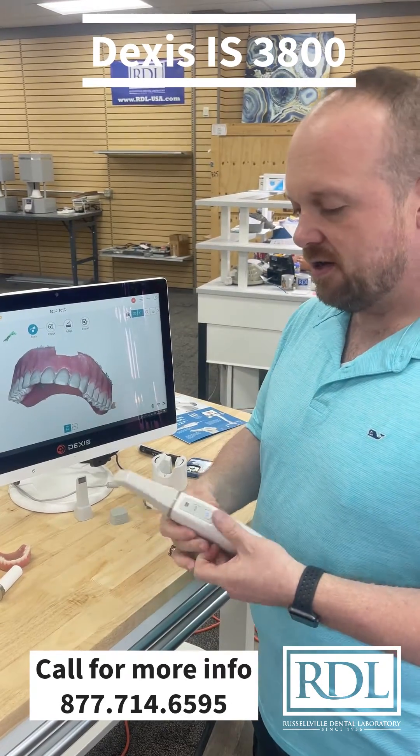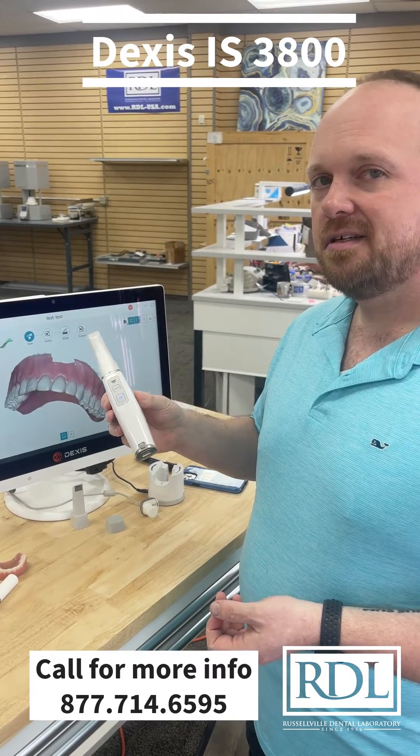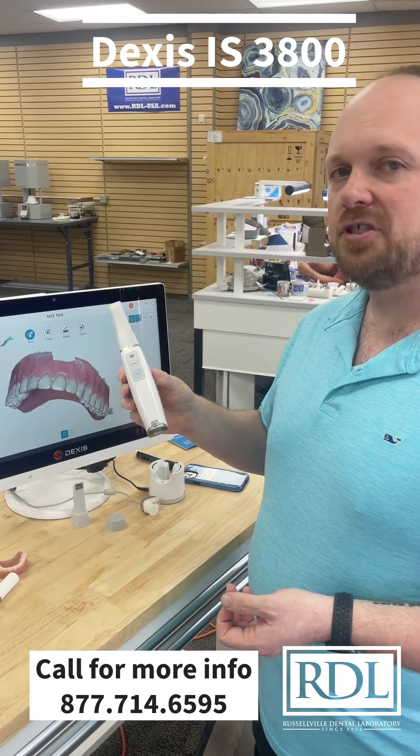Really nice scanner — the DEXIS IS3800, available from Envista. Check it out; give us a call if you're interested in more information.